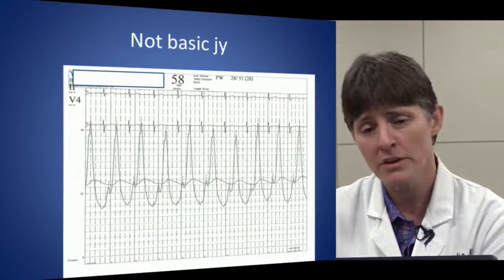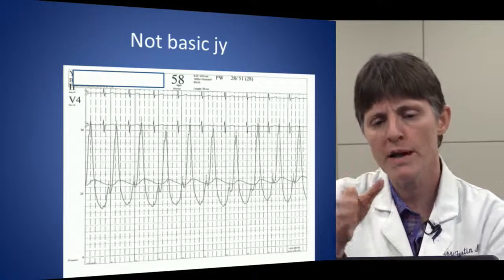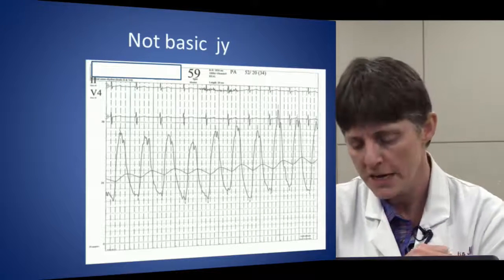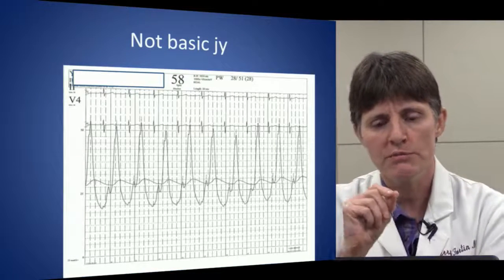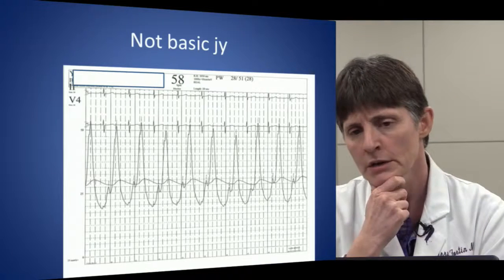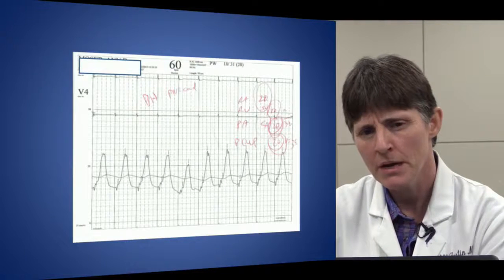Am I still in the pulmonary artery? I have this big triangular tracing. But here you don't. There's a little A wave, there's a big V wave. So this giant V wave is what's making this little glitch on this other PA tracing. And again, somebody with bad mitral valve disease. So you'd have to be very careful that you're not out there thinking, I'm still in the PA, I have a triangular tracing, when it's not. So time your tracings with your EKGs.